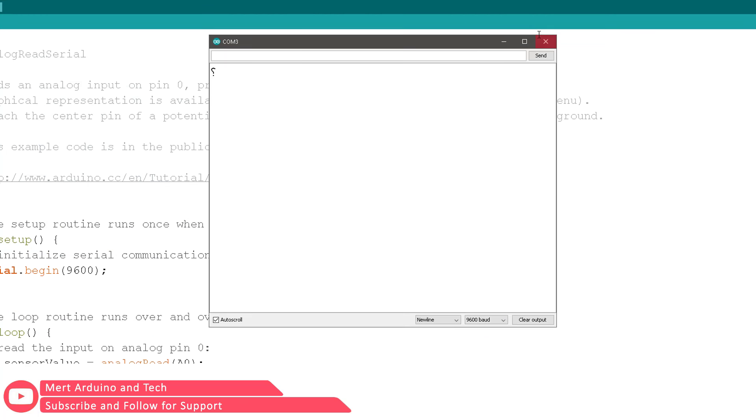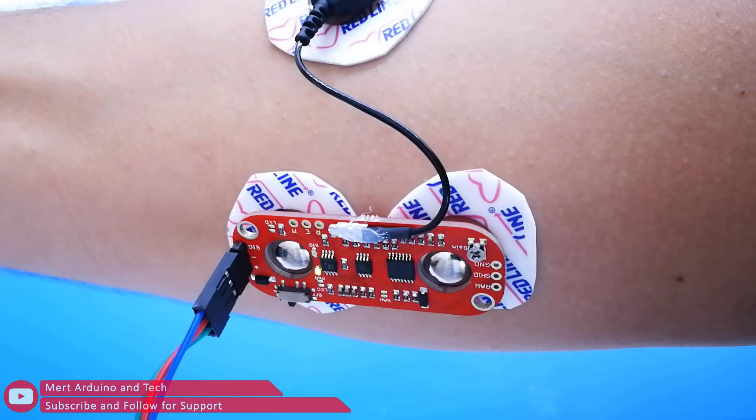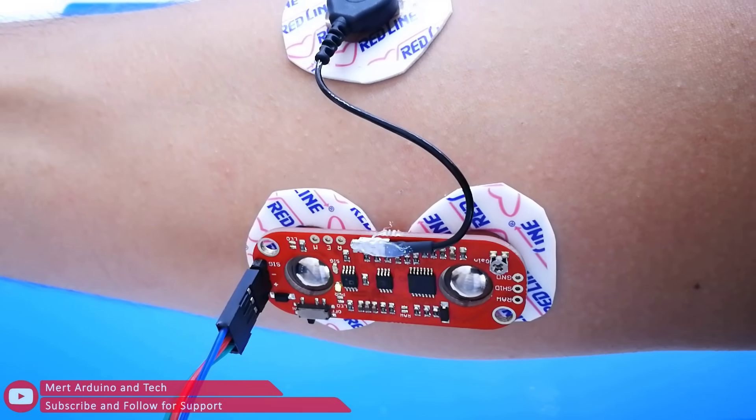Open up the serial monitor in Arduino and make a fist. When you flex the muscle, the values increase, and when released they will decrease.